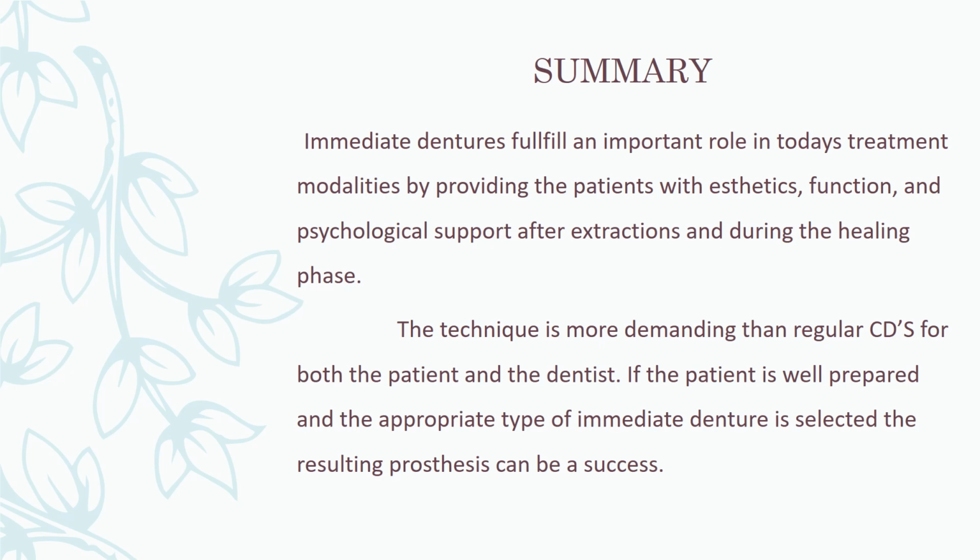Coming to the summary, immediate dentures fulfill an important role in today's treatment modalities by providing the patient with aesthetics, function, and psychological support after extraction and during the healing phase. The technique is more demanding than regular complete dentures for both the patient and the dentist.